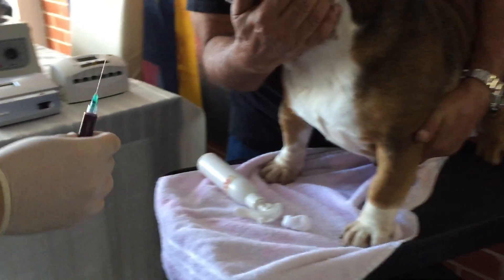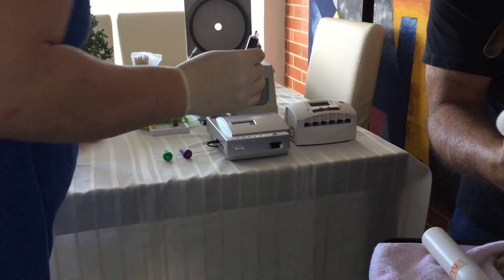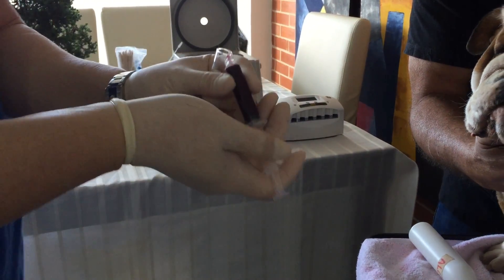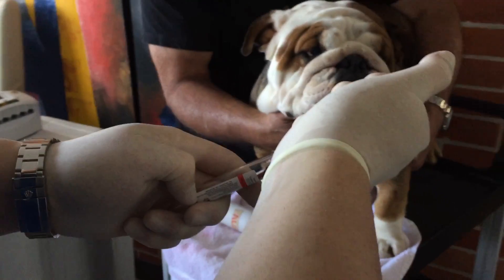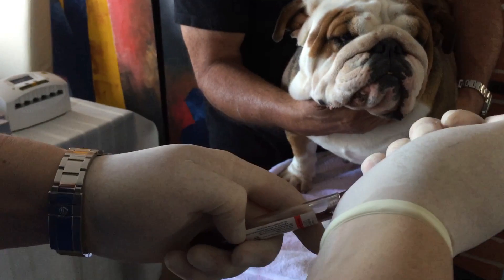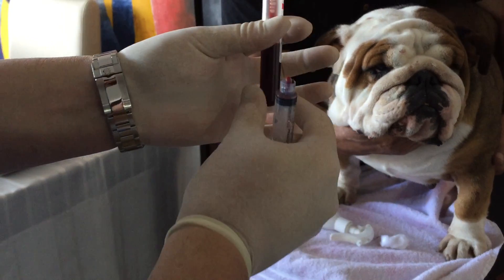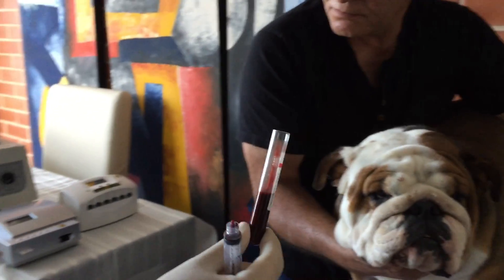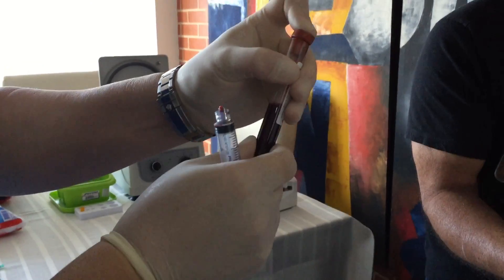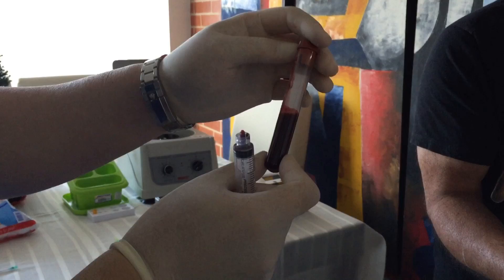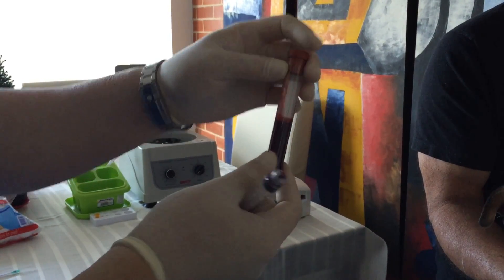So now we're gonna do the progesterone test. You want to slide down the blood really slow down the side of the test tube. Alright, so we have the 5cc, and now I let it sit for about 10 to 15 minutes. The more you let it sit, the better serum you're gonna get. So I wait until it coagulates and we're gonna run the test.